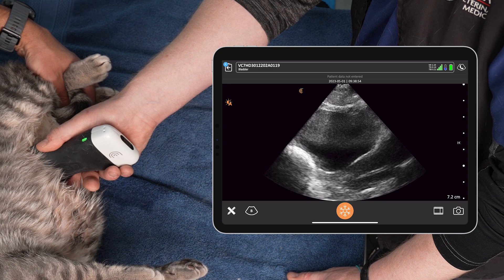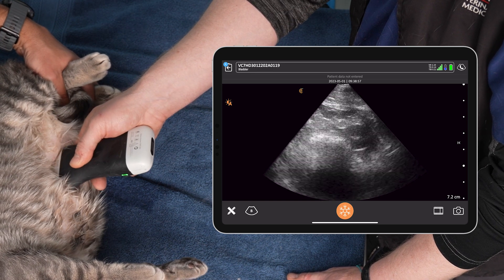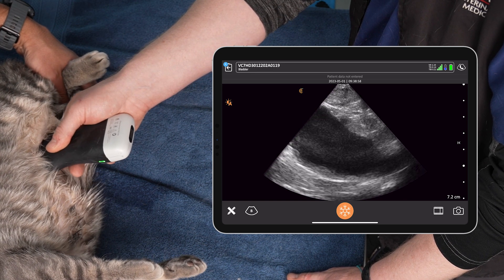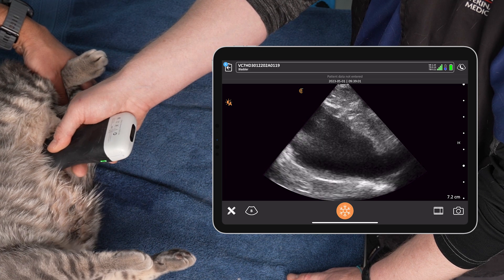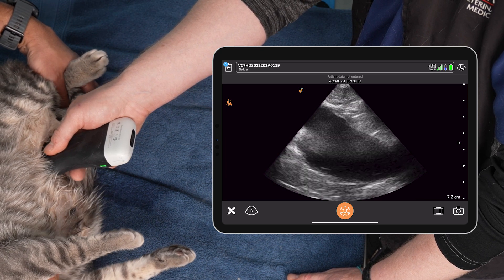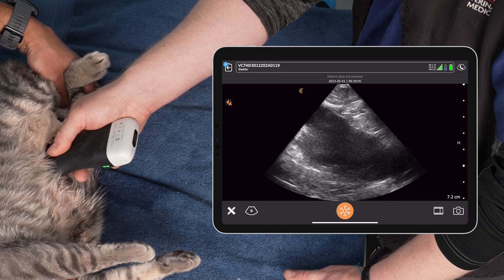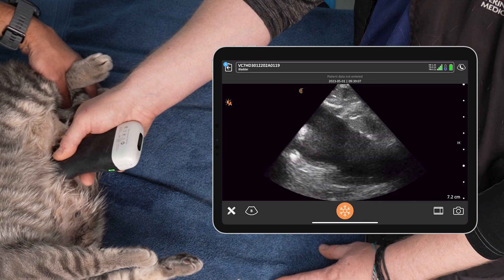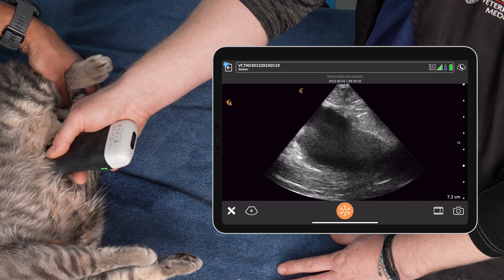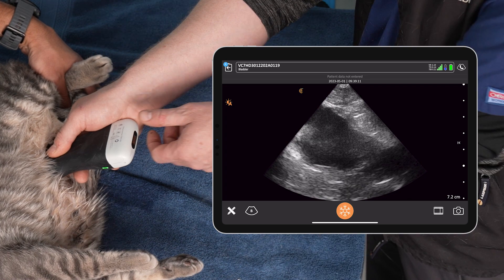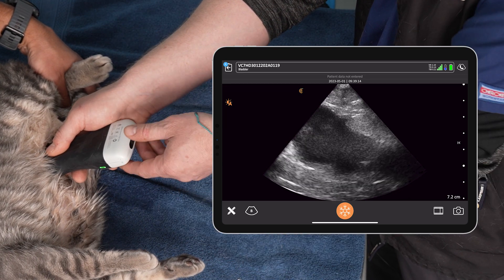We get a width and a depth in short axis, then rotate into long axis and fan and sweep until we reach the widest point of the urinary bladder, again coming in perpendicular to get a length and a depth. Using those measurements you can calculate urinary bladder volume using the formula for an ellipsoid or sphere — you can see how that's done in our webinars.